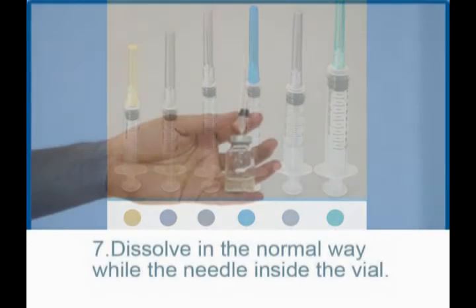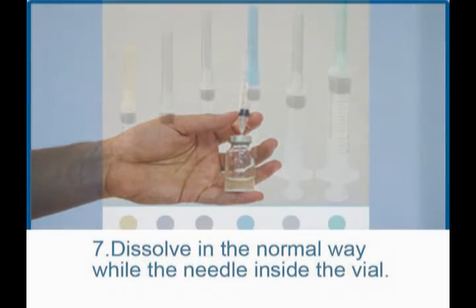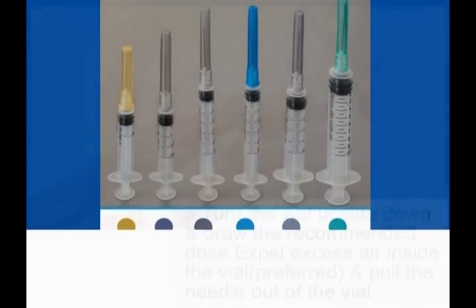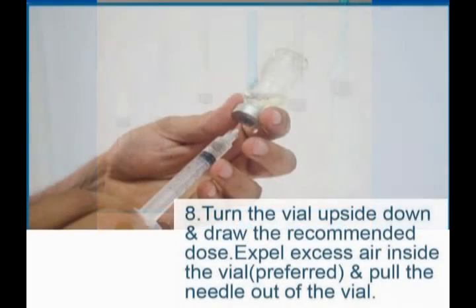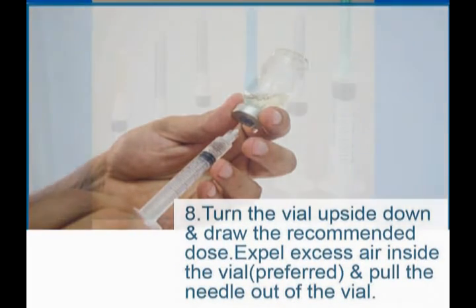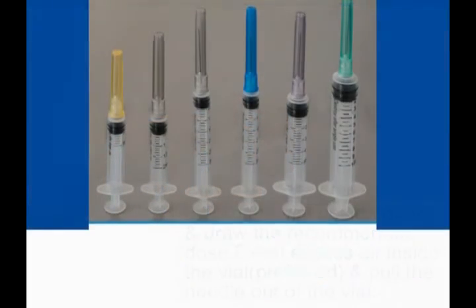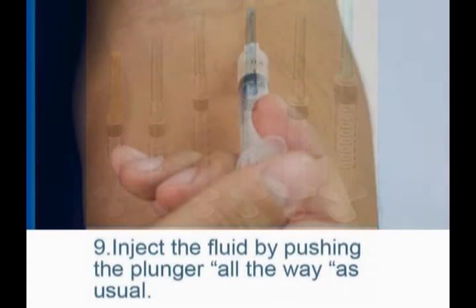Dissolve in the normal way while the needle is inside the vial. Turn the vial upside down and draw the recommended dose. Expel excess air inside the vial if preferred and pull the needle out of the vial. Inject the fluid by pushing the plunger all the way as usual.